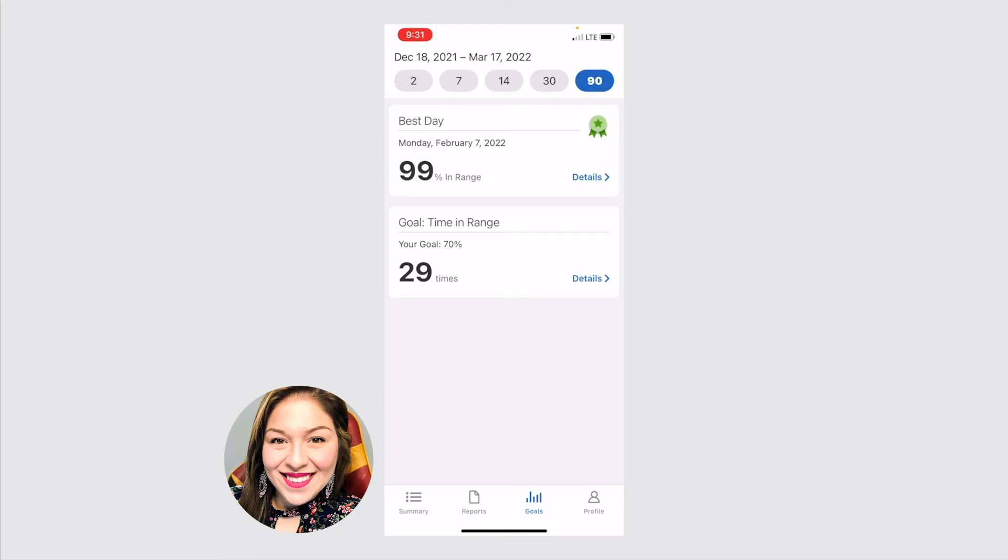And then it shows you what your goal is. So my goal is to be in range 70% of the time. And I did that 29 times in the past 90 days. So this is a really good way to kind of look back and see what have I been doing. And has that been helping me reach my goal.